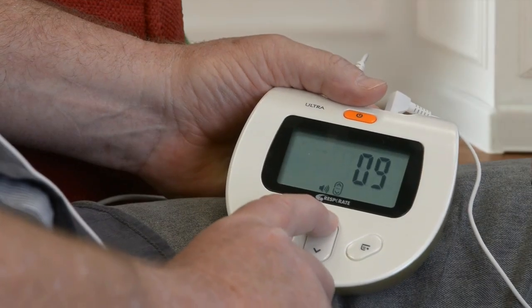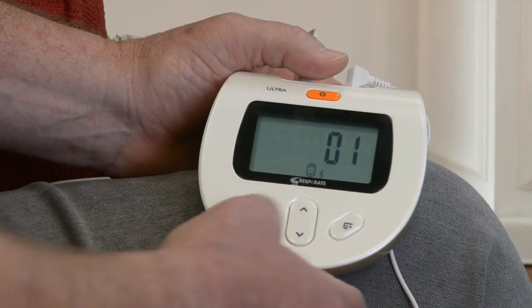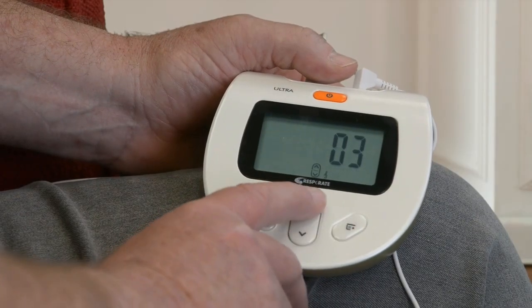A few more points. If you want to change the volume during your session, all you need to do is press the arrow up. To decrease it, all you need to do is press the arrow down. To change melody, all you need to do is press the menu button one time. Melody selection. Then you can scroll through to my favorite, number 3. If you have trouble following the guiding tones, change to melody number 4. Melody selection. Which only has 2 tones.